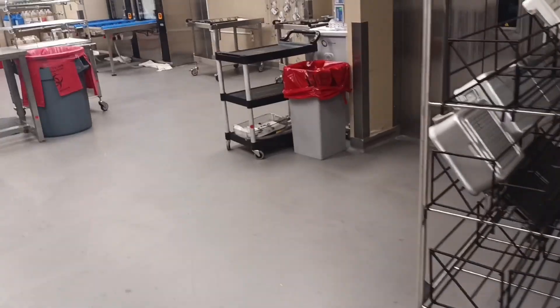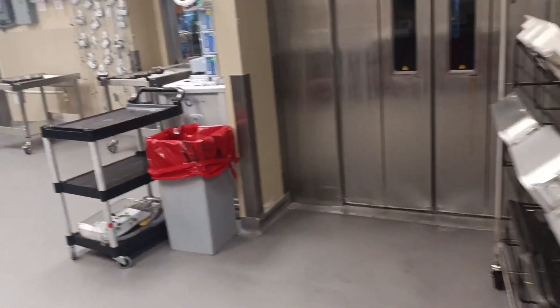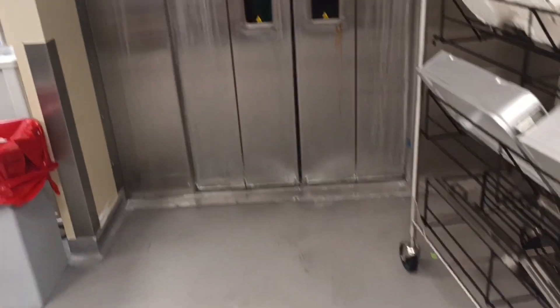Today I'm going to be taking you through the Decon Tam and I'm going to be showing you what the Decon Tam looks like. The Decon Tam is the part of the department where all the dirty instruments from the OR come to. This is where everything is being cleaned and sent to the other side.